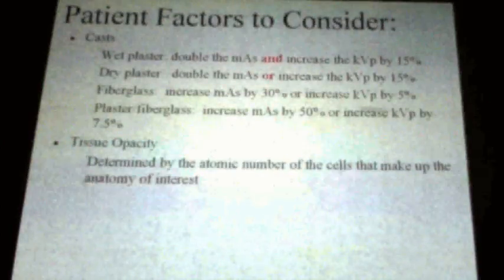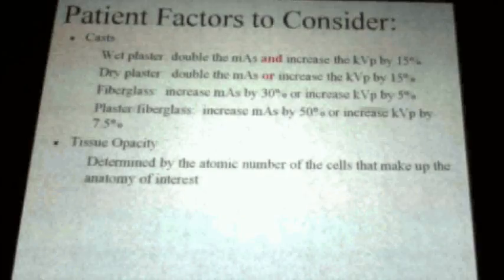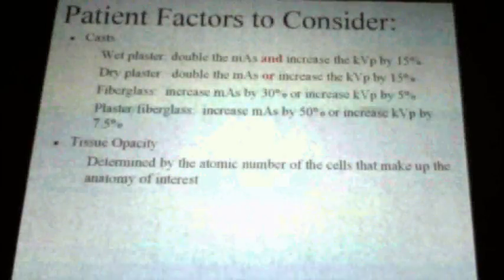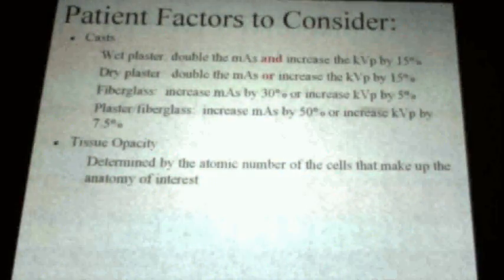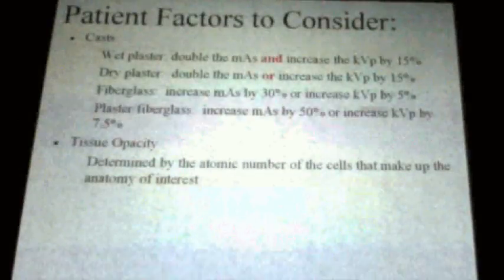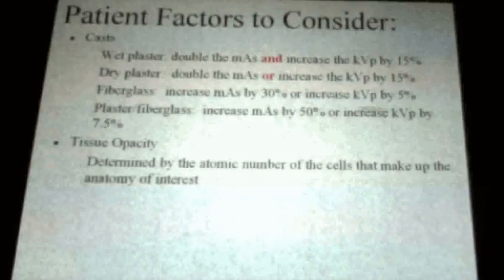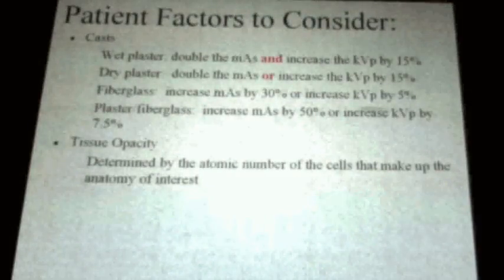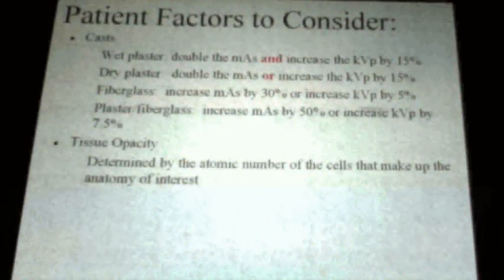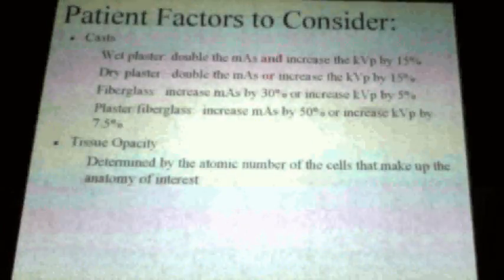Let me ask you this. You have a patient lying on top of the table, right? That table is made out of something, isn't it? It's physically made out of something. So my question is, why doesn't the table show up on your image? You ever thought about that? Why doesn't the table show up on there? It's made out of something, isn't it? It's solid. It seems like you should have an image of the table on top of the patient, wouldn't you?